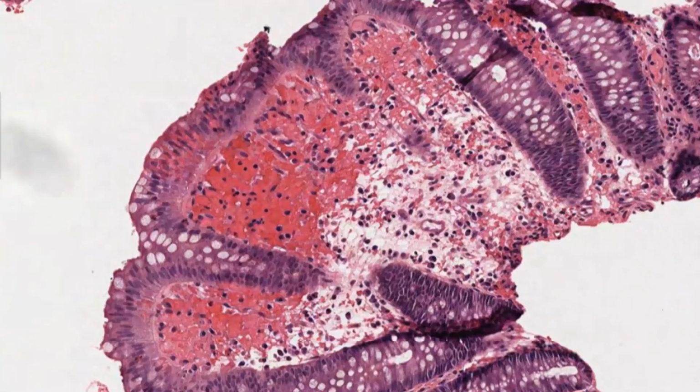This is the difficulty of ischemia, that when you see it in a biopsy, if you don't think of it, especially in an elderly person, you will miss it, right? You will definitely miss it.